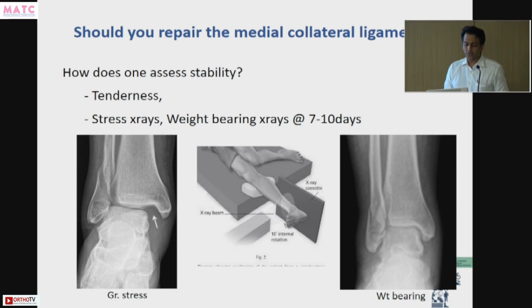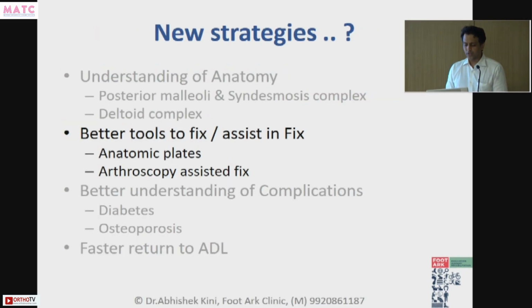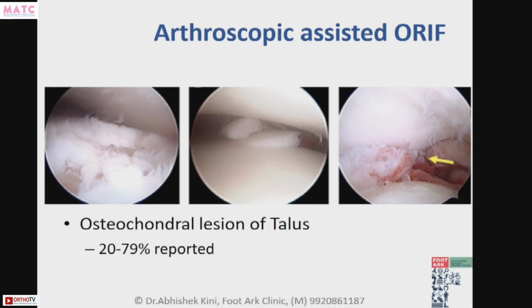So it's important that you diagnose them, and this is done normally at 7 to 10 days when the patient is relatively pain-free. Again, you need to estimate it and make sure that you repair it. Better tools to assist in fixation are better anatomic plates nowadays, what sir showed already. Better fragment-specific plates are there. Arthroscopy-assisted ORIF is done especially for osteochondral lesions of the talus and the syndesmosis, which we'll be showing.